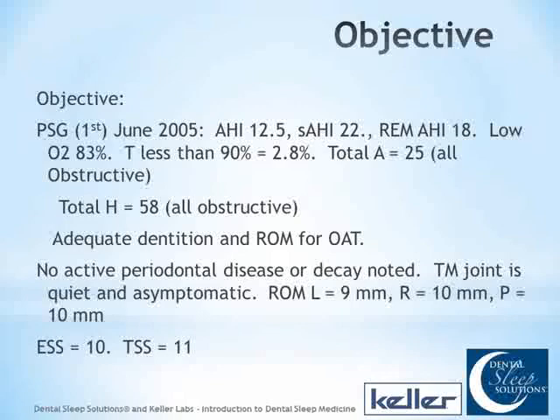And the other thing I might add, too, is every now and then, we see people who have mild sleep apnea and they lose 100 pounds and they're still wearing CPAP. We've treated them and they don't have sleep apnea anymore when we retest them, but they still might snore and they still might want a dental device. But those are all good points. I've seen people that had lost 100 pounds.